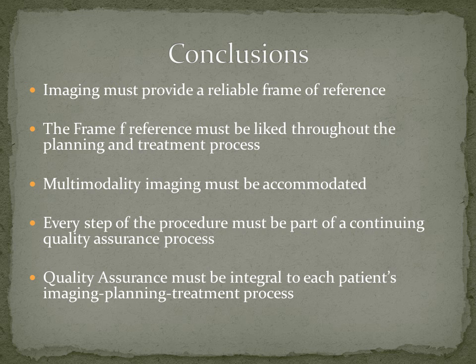So in summing all this up, the imaging has to provide a reliable frame of reference. The frame of reference has to be linked throughout the entire planning procedure and the entire treatment process. Multimodality imaging has to be accommodated. You have to be able to have the best imaging available to you that gives you the best contrast with the best spatial resolution to do these procedures.